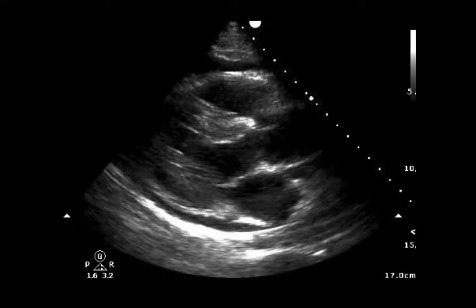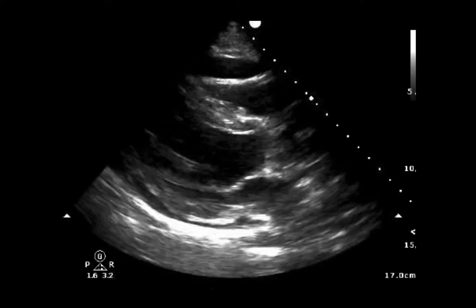I always have a hard time having my eye look two places at once, so I'll use the M mode tool.